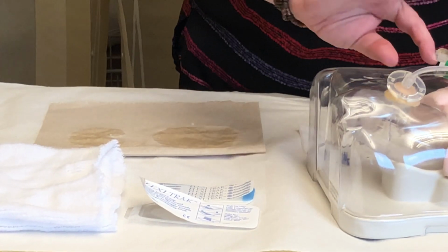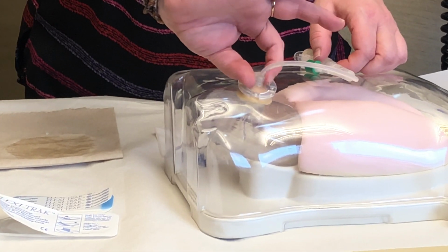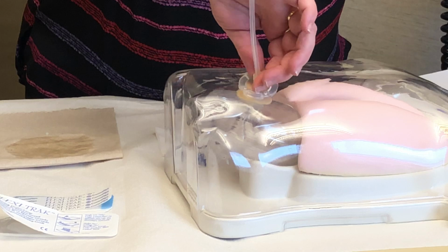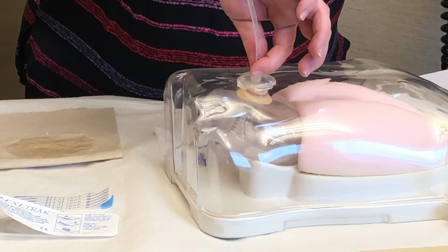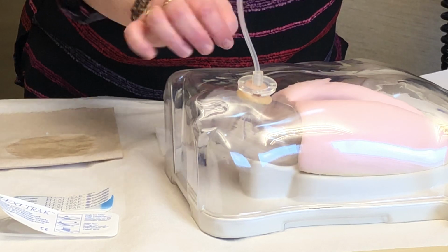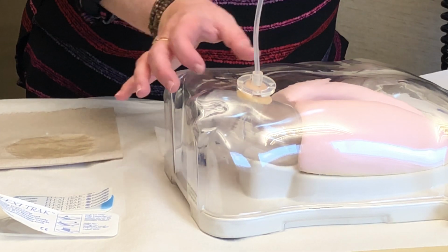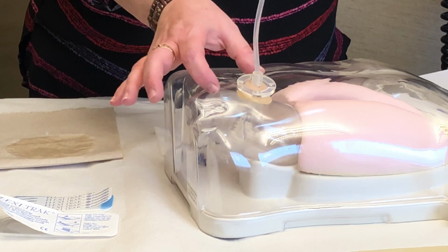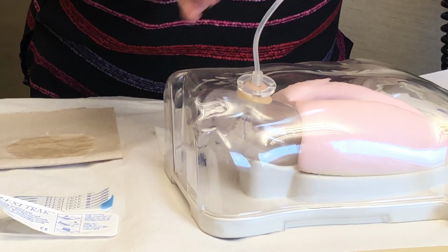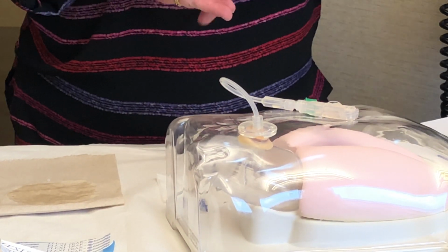Last thing we're going to do with your tube is turn and move the tube. We want to grab the skin disc and move this as one piece. We're going to do a complete rotation of the tube, bring that back around, and then move the tube in and out. What we're doing is making sure that your internal piece, either a bumper or a balloon, is not adhering to your stomach or intestinal wall. So once that's done, we've now cleaned it, we've turned it, and we've checked the site.